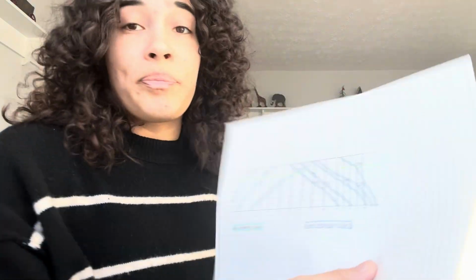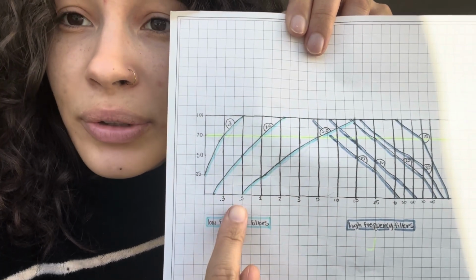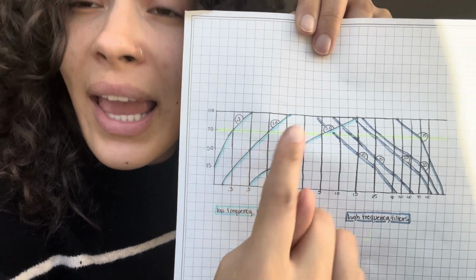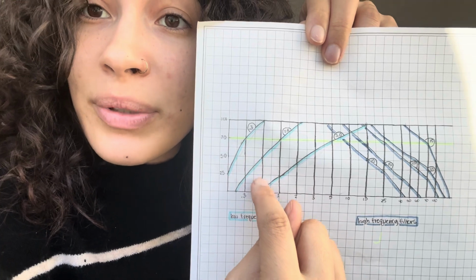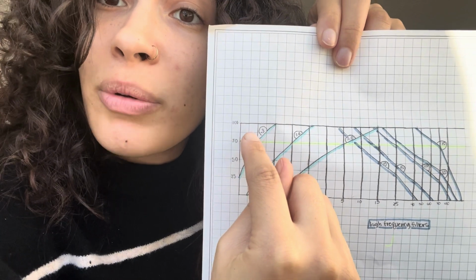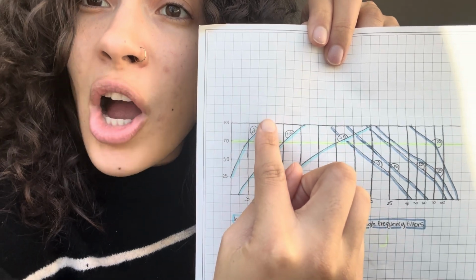A low frequency filter of 0.3 instead of 1 is going to allow us to see slower frequencies, and we can see that demonstrated in the graph. At our standard 1, if we have a frequency of 0.5, it's only going to show 50% amplitude of that frequency, so it'll be attenuated 50%. But if we lower our filter and use a 0.3 filter, then that same 0.5 we can now see 100% of. So that would be an advantage of lowering the low frequency filter.